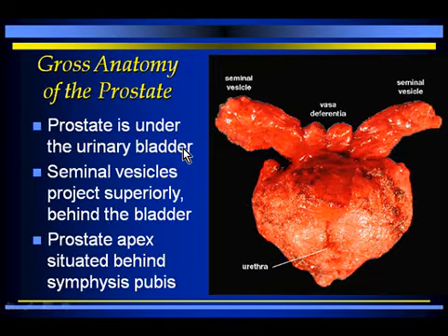Okay, so we've finished our rapid discussion of the scrotum now. We've discussed testicular masses and extratesticular masses. We've discussed the acute scrotum. We've talked about the distinction between epididymitis and epididymo-orchitis on the one hand and testicular torsion on the other hand. These are very important topics, and these are the two most important reasons you'll be asked to look at the scrotum: evaluation of tumor and evaluation of the acute scrotum.